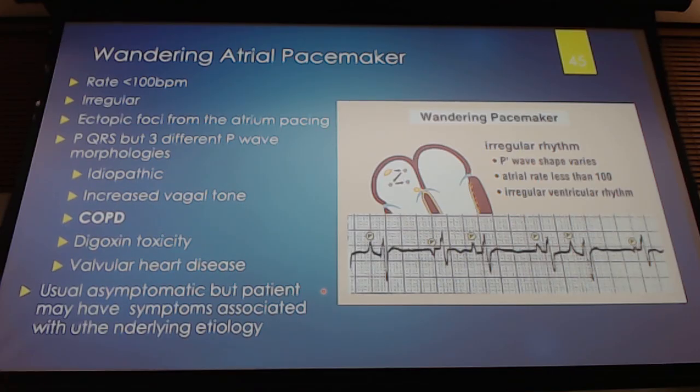What does that sound like? Multifocal atrial tachycardia. Well, that's this. But our rate is less than 100. The reason for people to get this is the same reason that people get thrown into multifocal atrial tachycardia. Severe respiratory disease, uncontrolled respiratory problems, asthma, COPD, maybe pulmonary embolism.